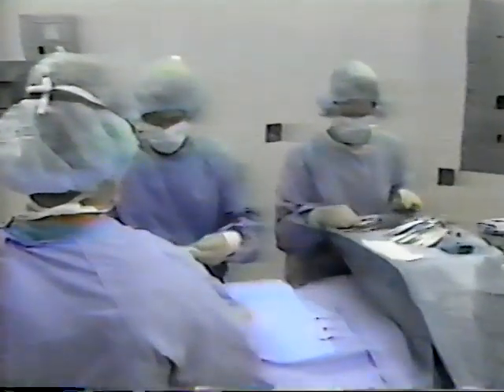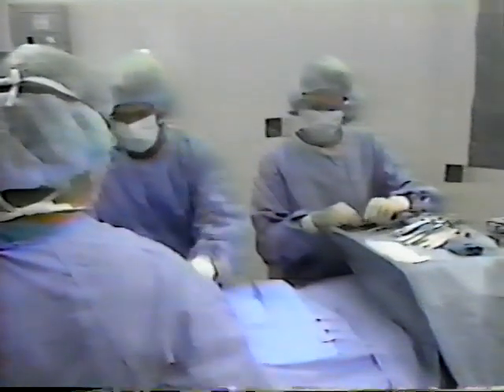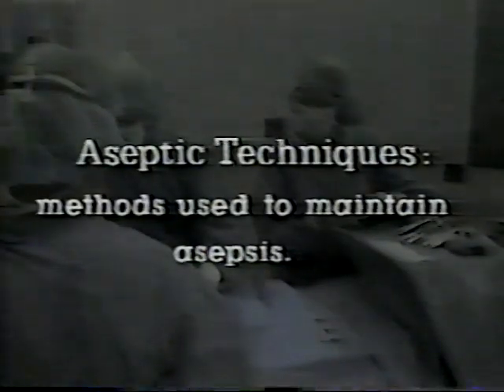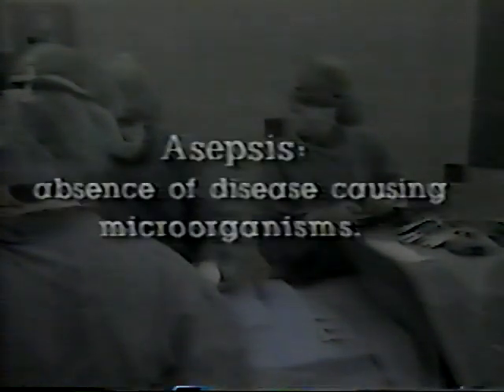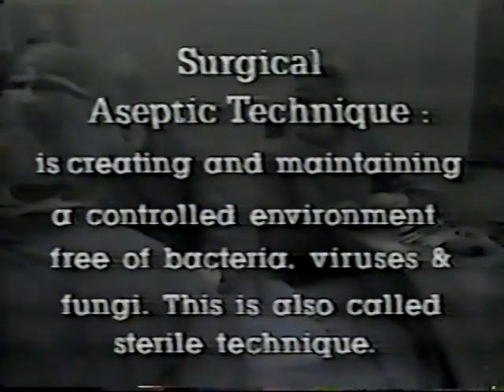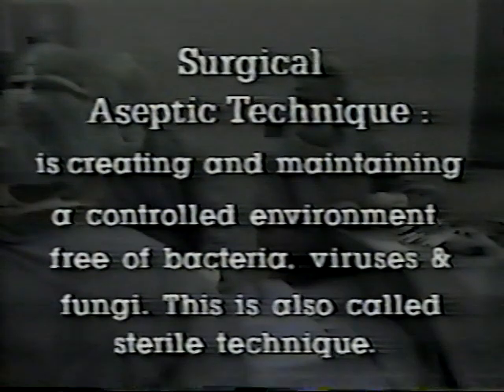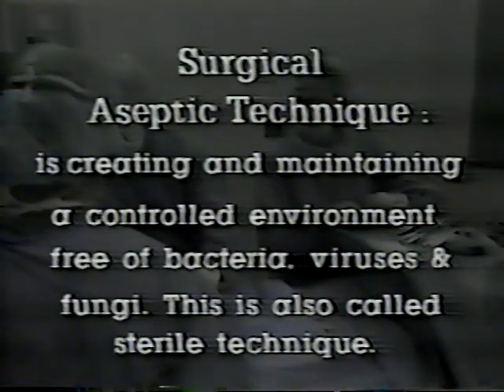An effective method of controlling infection in the operating room is through the use of aseptic technique. Aseptic techniques are the methods used to maintain asepsis. Asepsis is the absence of disease-causing microorganisms. Surgical aseptic technique is creating and maintaining a controlled environment free of bacteria, viruses, and fungi. This is also called sterile technique. Sterile means being maximally free of all microorganisms.